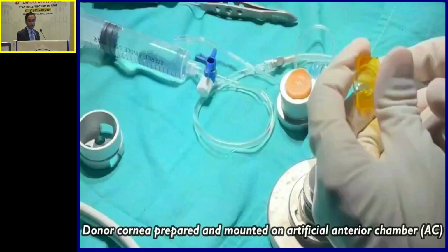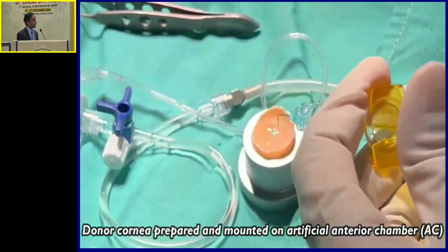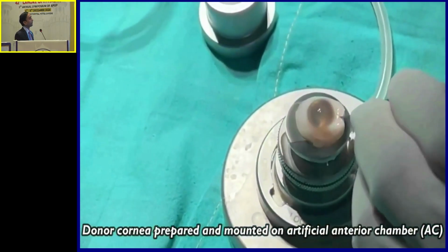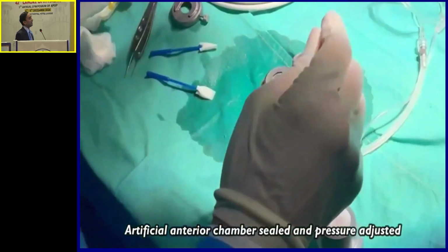So this is the video of the surgical steps. The donor cornea is prepared and mounted on the artificial anterior chamber. The artificial anterior chamber is sealed and the pressure is adjusted.